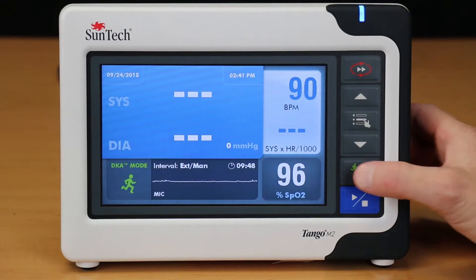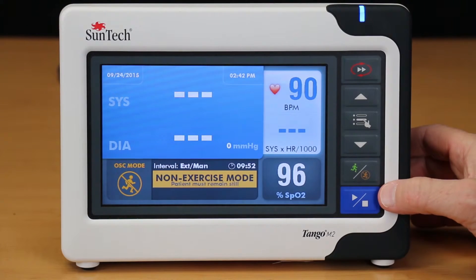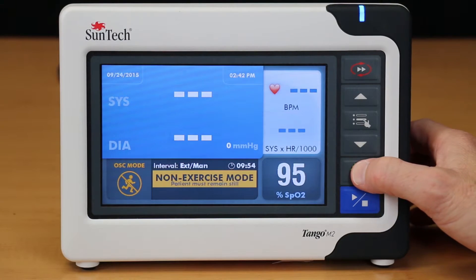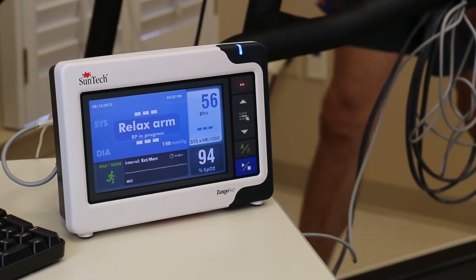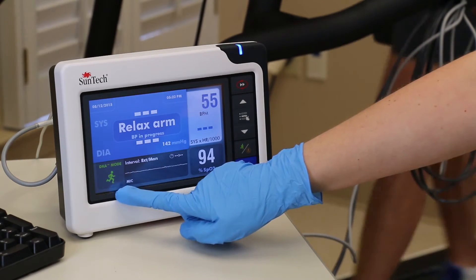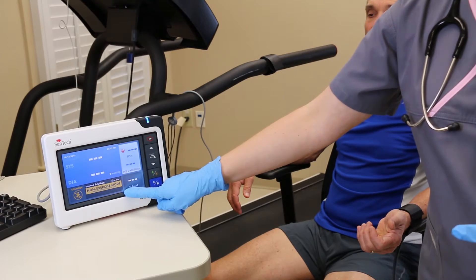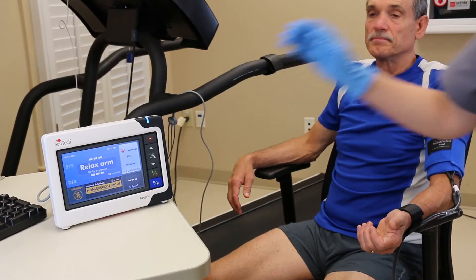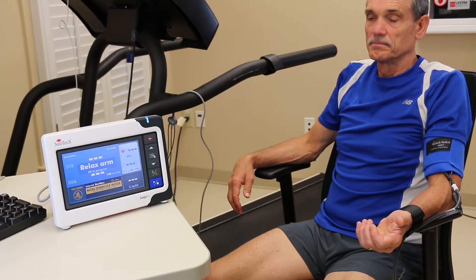On the right side of the Tango M2, on the button panel, is a button with a green running man icon and an orange non-running man icon. This button allows the Tango M2 to toggle between DKA and OSC modes. When a patient is on the treadmill or ergometer, the Tango M2 must be in DKA mode. However, if you need to take a reading on a patient who is not connected to the ECG electrodes, you can press this button to switch to OSC mode. Please note that OSC mode is not motion tolerant and cannot be used during a stress test.